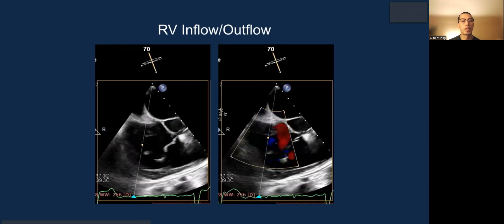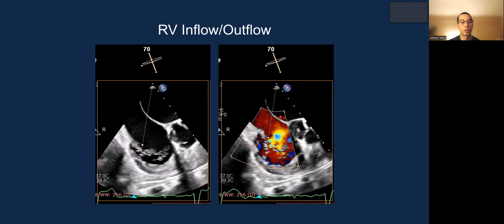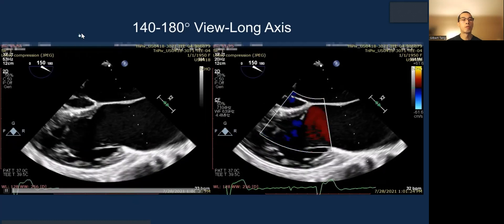The septal leaflet is restricted, but it does reach the annulus in systole. This is torrential TR, and you can see the very horizontal right ventricle as well.